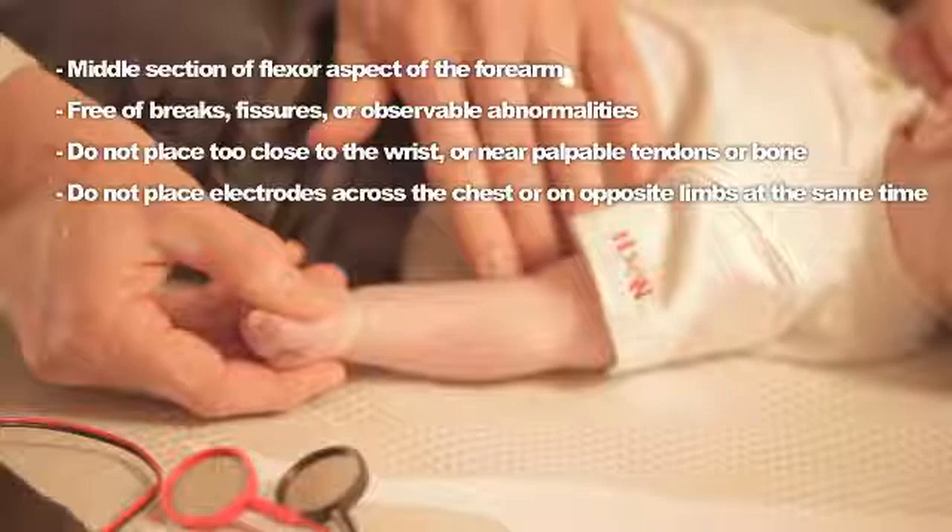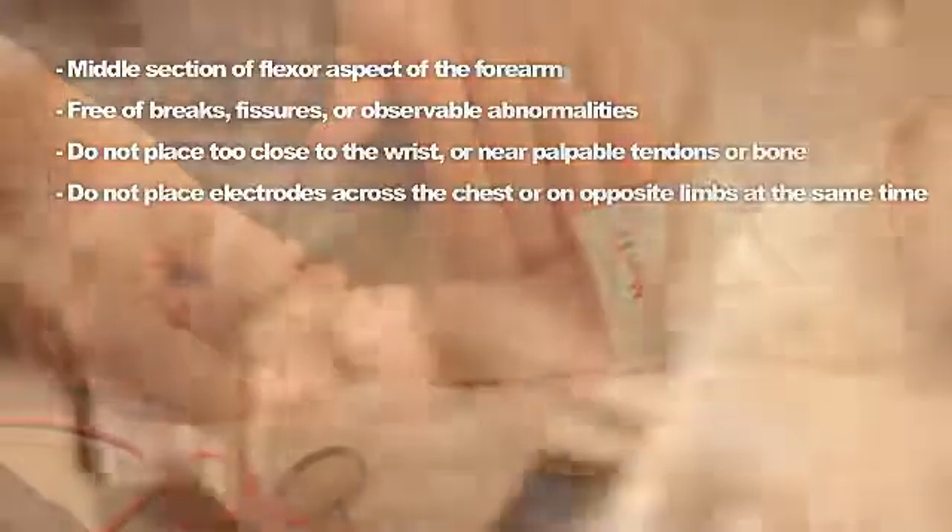Do not place the electrodes so close to the wrist that the tendons or bones are palpable just beneath the skin. Do not place electrodes across the chest or on opposite limbs at the same time. Clean the skin at selected sites to remove dirt, oil, and loose dead cells to minimize the electrode's impedance of the skin.